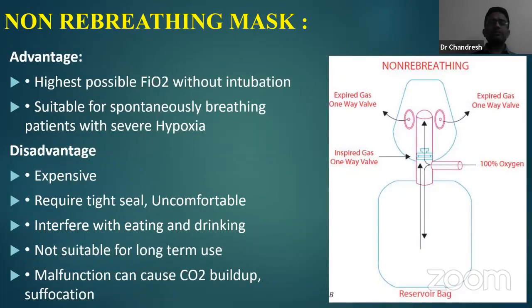Non-rebreathing mask also has some advantages. Here, the major advantage is the highest possible FiO2 we can give without intubation. So if somebody asks, if you want to deliver 95 or 100 FiO2, which mask will be useful? It is a non-rebreathing mask. It is suitable for the spontaneous breathing patients with severe hypoxia.